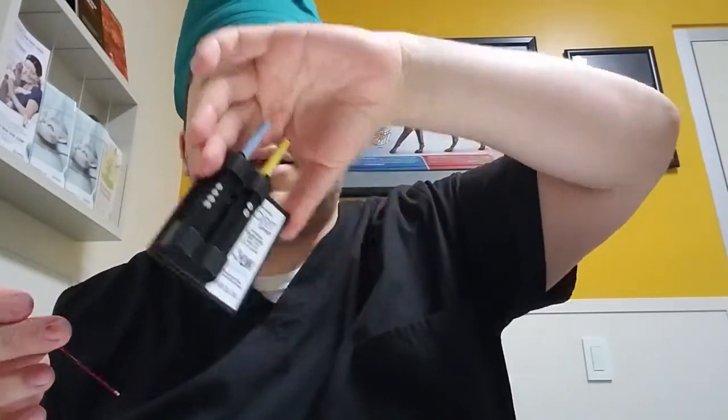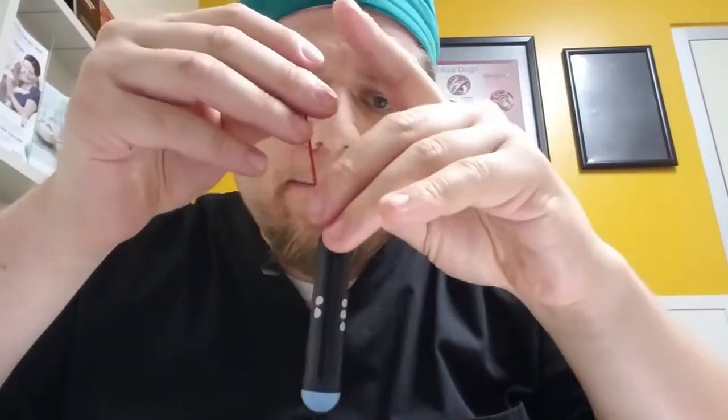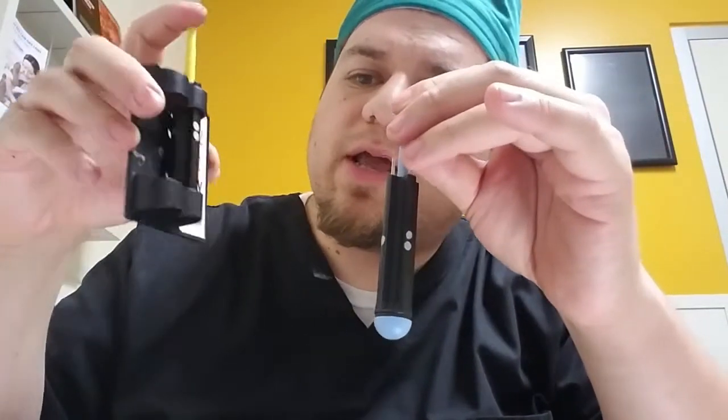Now I'm going to put it in — this is called a crit carrier. This is what I'm going to spin it in the centrifuge. I labeled it already, so I'm going to put it in slot one. And I'm going to do another one so that since the centrifuge has to be balanced, I'll put one on either side so it is balanced.